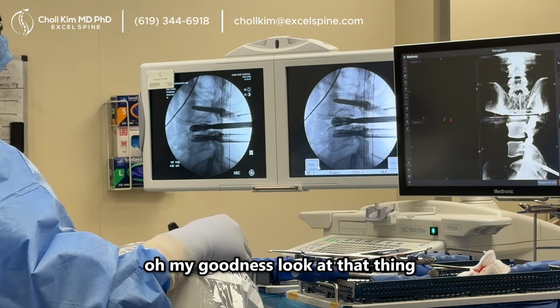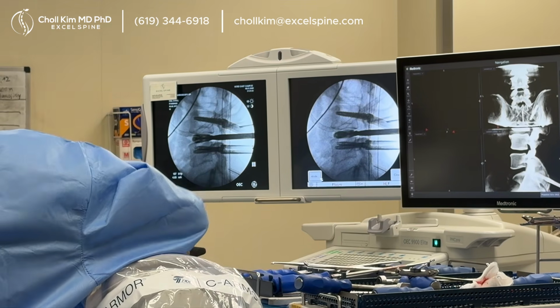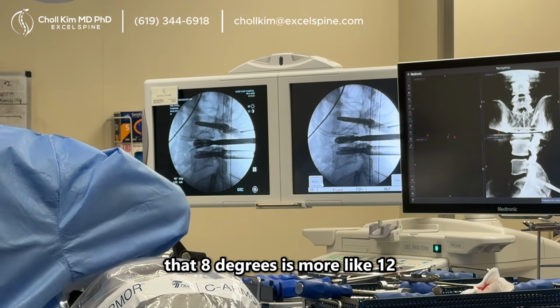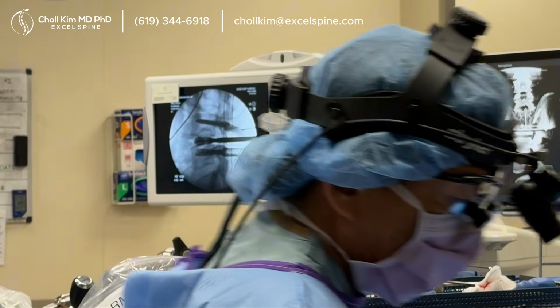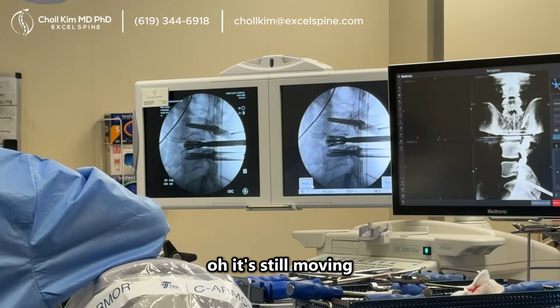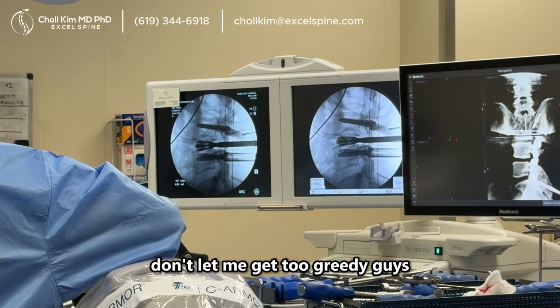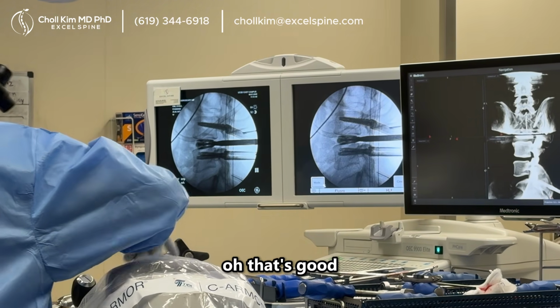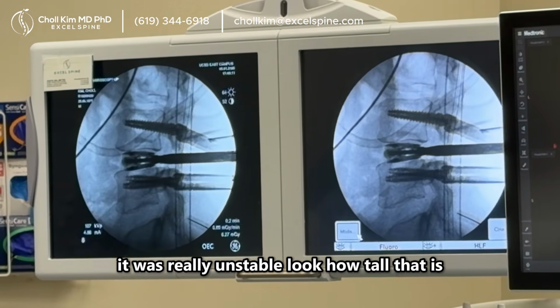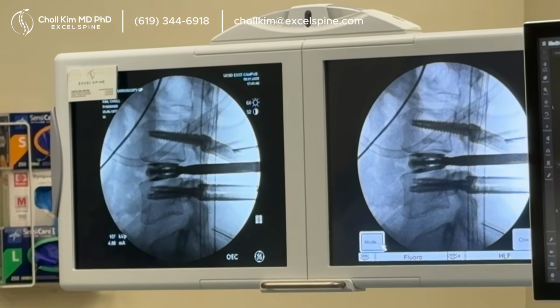Oh my goodness, look at that thing back and forth. It's obscene. Okay. Nicely tucked. Man, that 8 degrees is more like 12. Love it. Shot and save. Oh, it's still moving. Good. Don't let me get too greedy, guys. Oh, that's good. He was really unstable. Look how tall that is. It's like an A-lift. Back and forth.